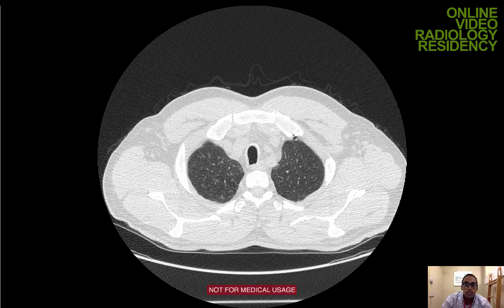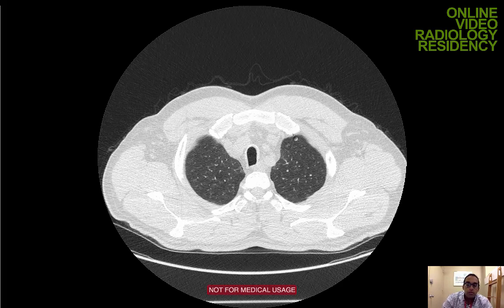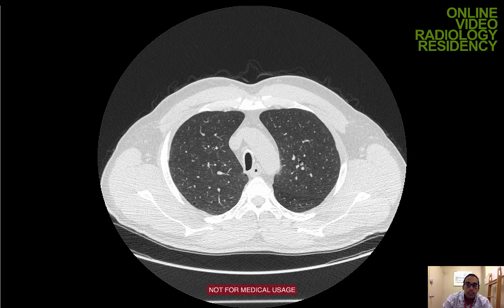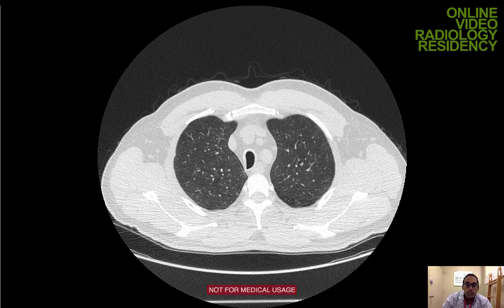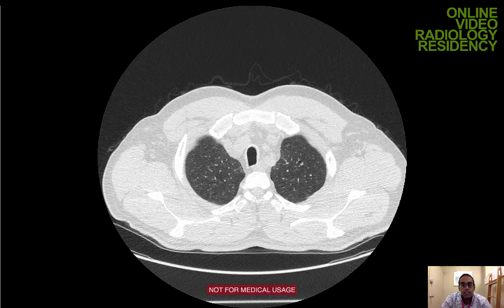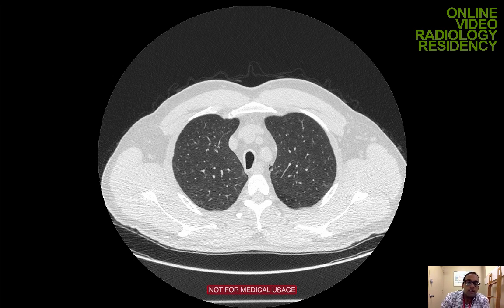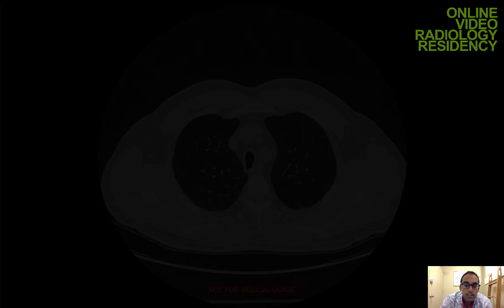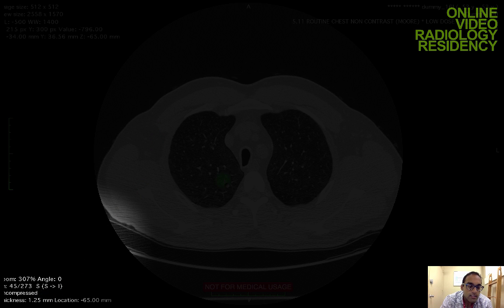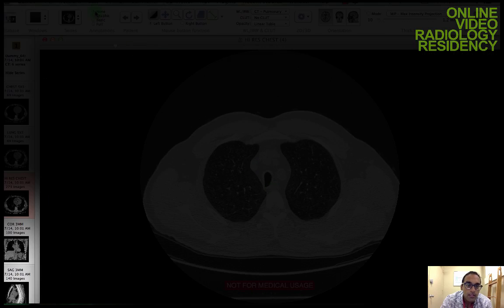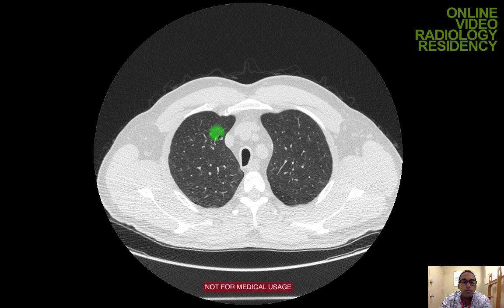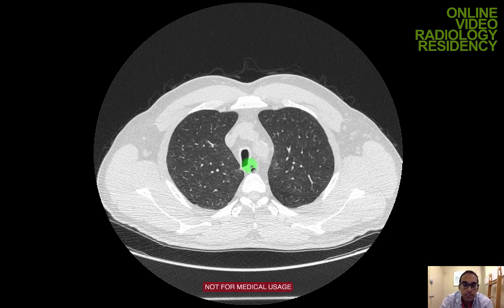Welcome to the section on non-contrast chest CT. I'm going to show you a basic search pattern for looking at a non-contrast chest CT. First, you want to start with technique. This is a non-contrast study done in the axial plane at thin sections — slice thickness here is 1.25 millimeters. This set of images is the best for evaluating the lung parenchyma, which is the main goal of a non-contrast chest CT.